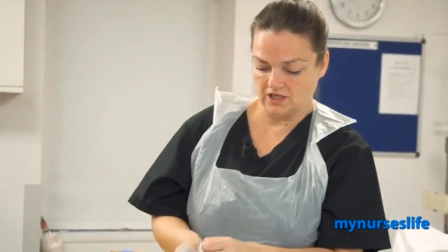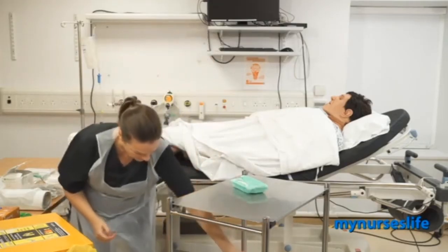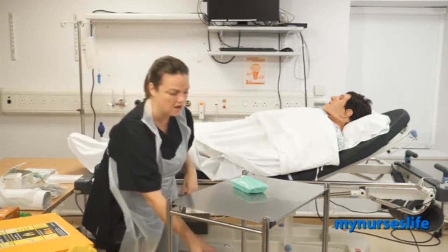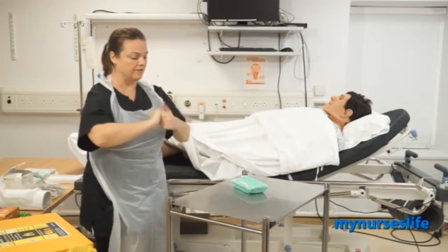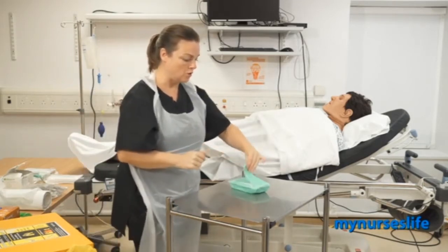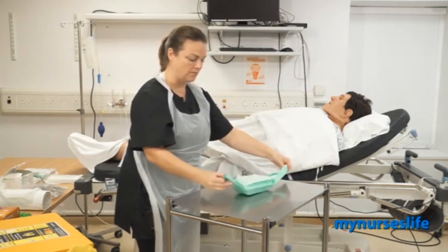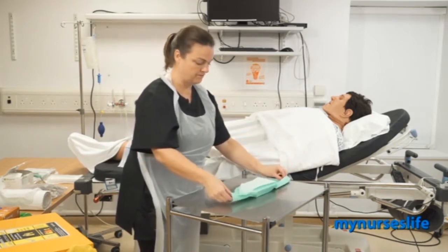Ensure you don't touch the clean trolley with the outer packaging. You can just pop that down underneath on the bottom shelf, and just gel your hands again before you open the pack, touching only the green under part of it or the very edges.